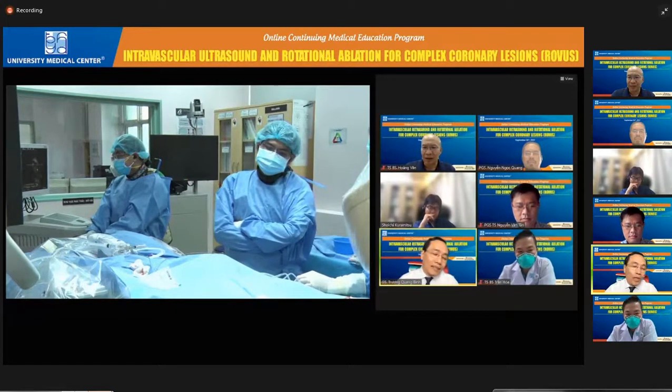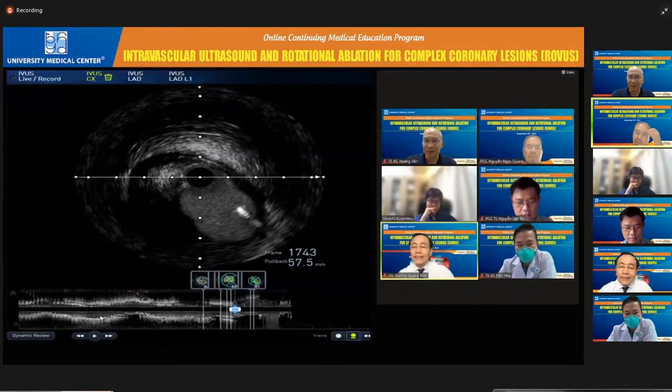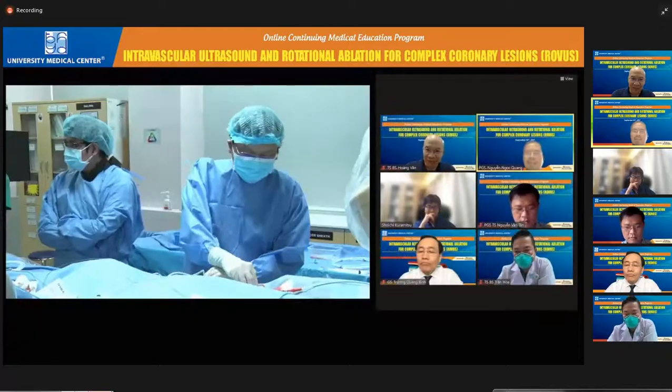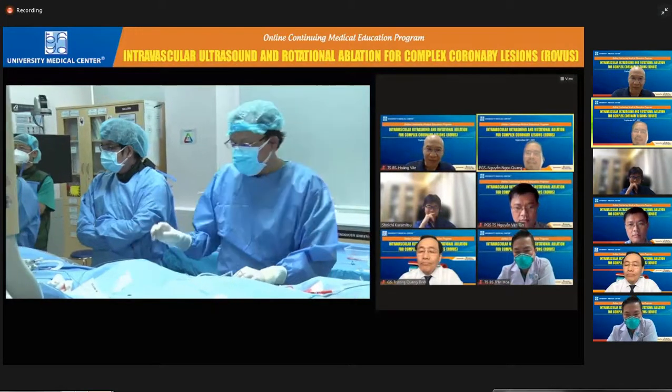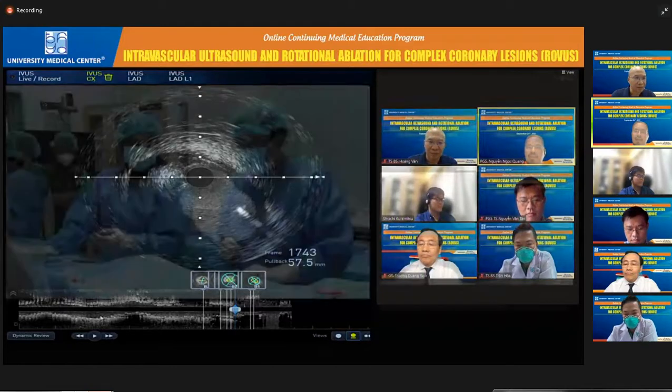Okay, Professor Nguyễn Ngọc Quang. Yeah, sorry, Professor Bing, I just checked again the criteria for inclusion of patients. It's up to you, but normally for a life-threatening case like that, we are not supposed to enroll the patient in the trial, I think.